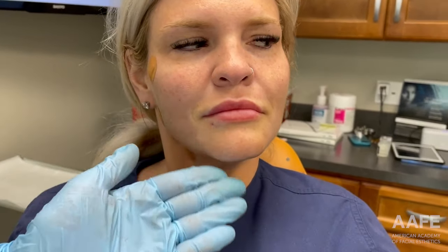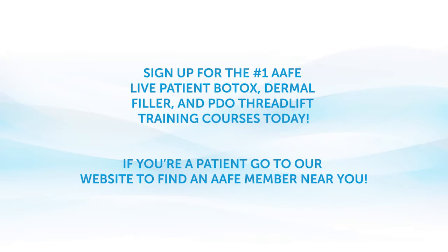We have just completed Lindsey's case. We ended up doing nine threads per side, including face and neck — four to the neck on both sides, and the rest in the face. You can see we have a much softer nasolabial fold. We've lifted this tissue which before was a little more crinkly, and then just a really nice jawline. Really happy with these results.